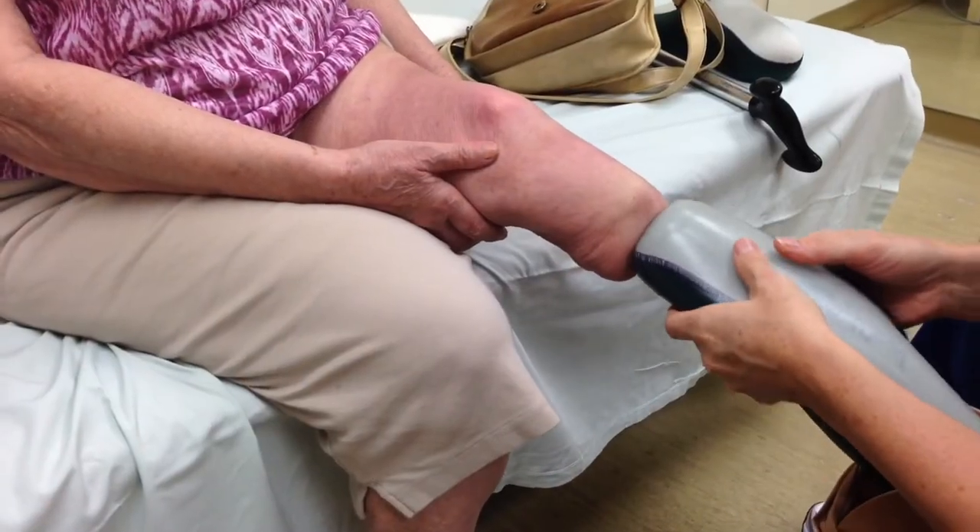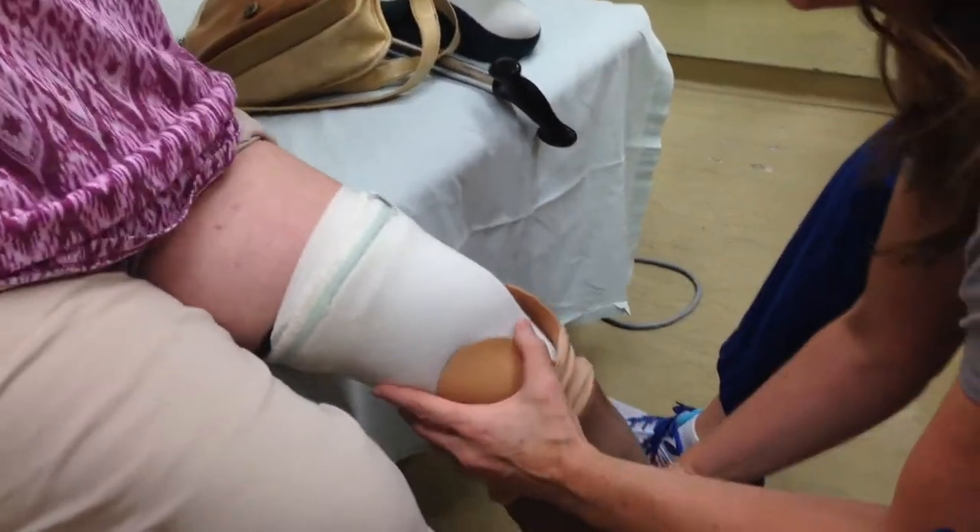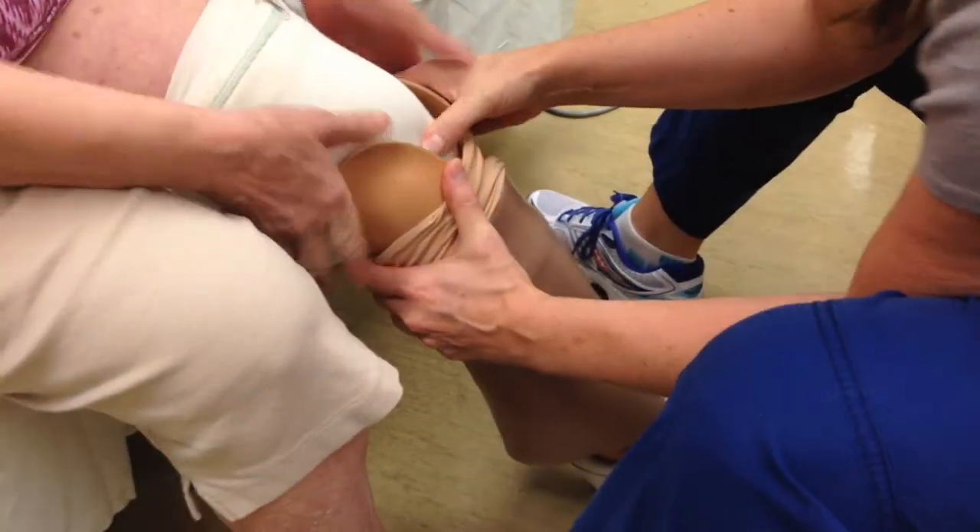You can put it on your prosthesis and make it your own expression for your own limb. It's kind of fun too — it's not all doom and gloom. It's a lot of fun.